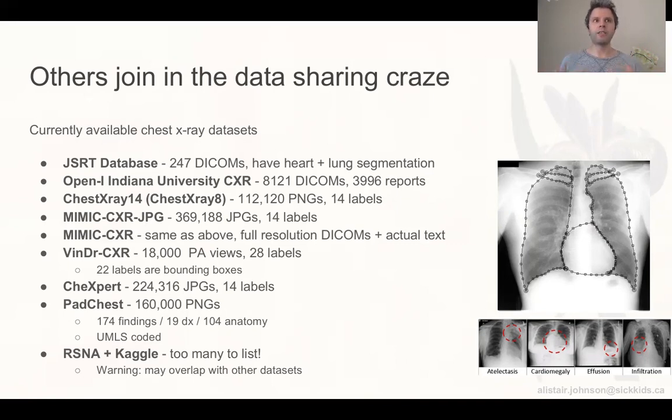So there's actually higher resolution in native DICOMs than there are in PNGs and JPEGs and those sort of compressed or uncompressed image formats for that reason. So very important to actually consider the data type that you're using. But there's a lot to sort of work with, which is very exciting.